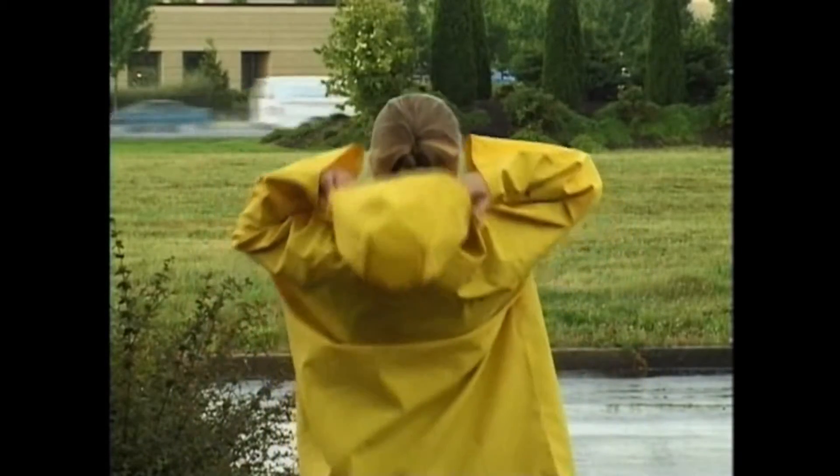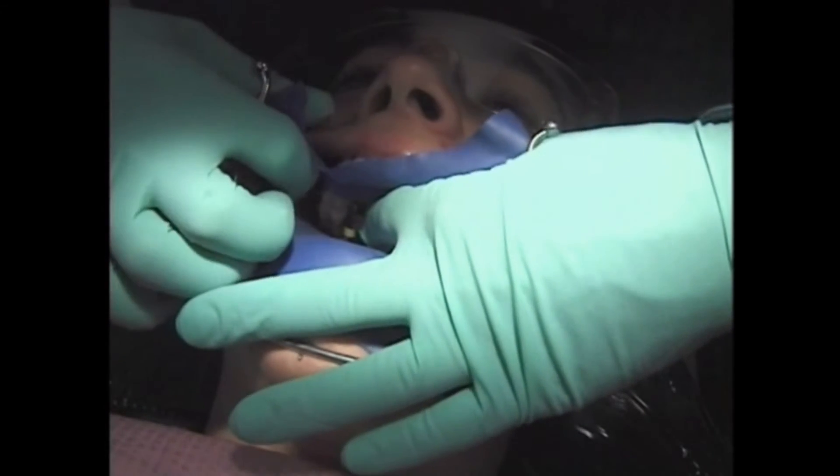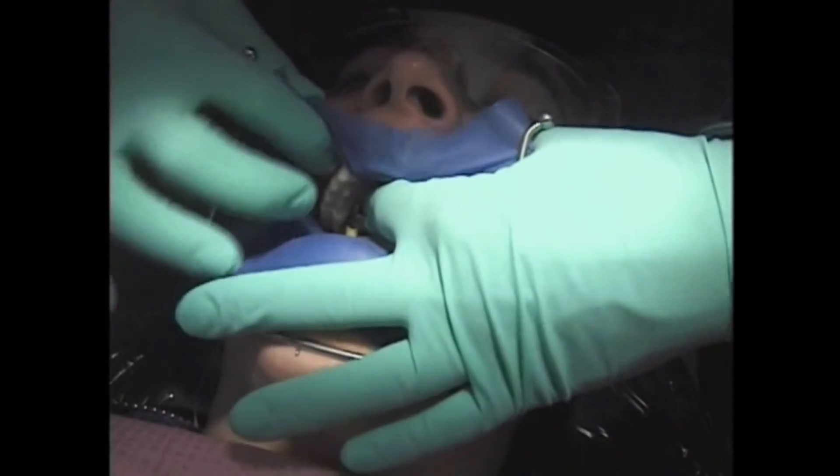When it's wet and rainy outside, it's always a good idea to wear a raincoat. Well, when we work on your teeth, we sometimes use a special kind of tooth raincoat.